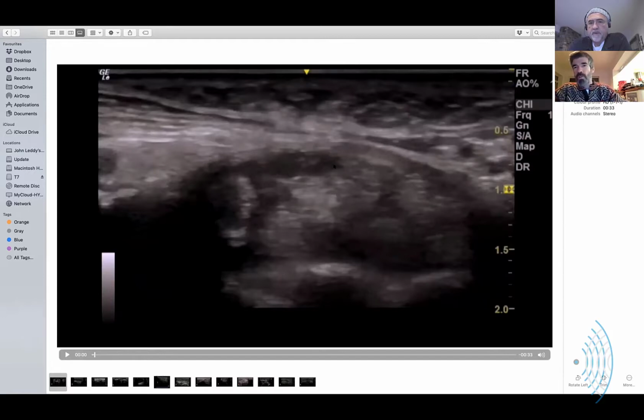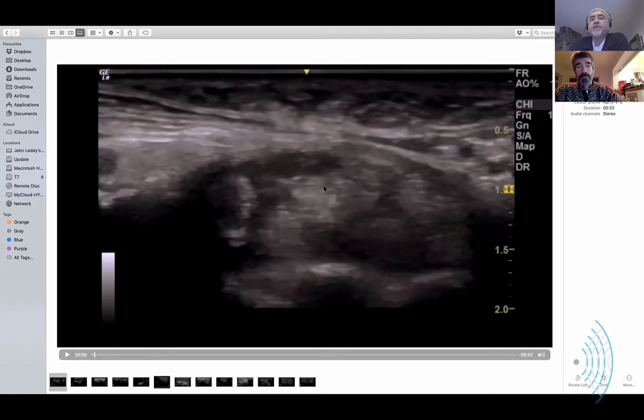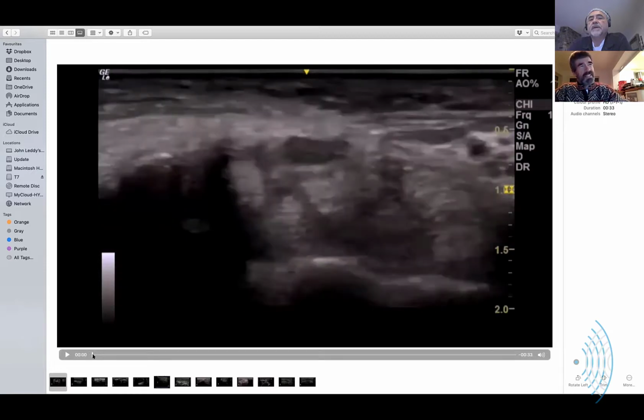But what I do is I watch the nerve as it comes from proximal. Does it swell up as it approaches the tunnel? Does it get bigger? Does it have a muffin top, or does it bulge on the proximal end of the nerve before it tightens its pants? So that's what you're looking for, this little blip of going from big to small as it goes under the tunnel. More that's big to small, but mostly normal to big is what I find.